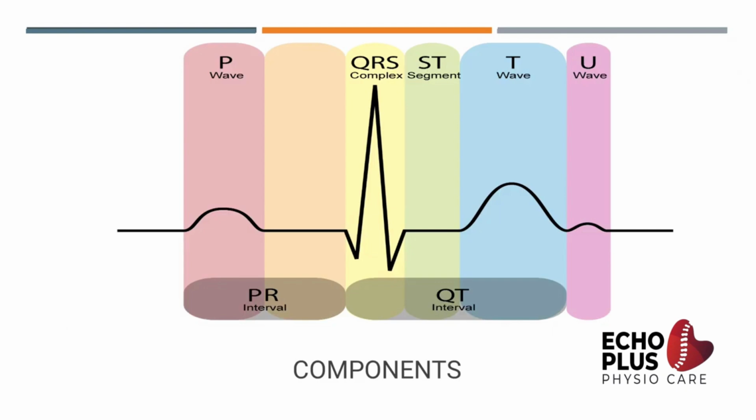Now often when you say ECG, what comes into your mind? Obviously the PQRST wave, and in this picture you can see an additional U wave. What is it? So we'll see the components of ECG.